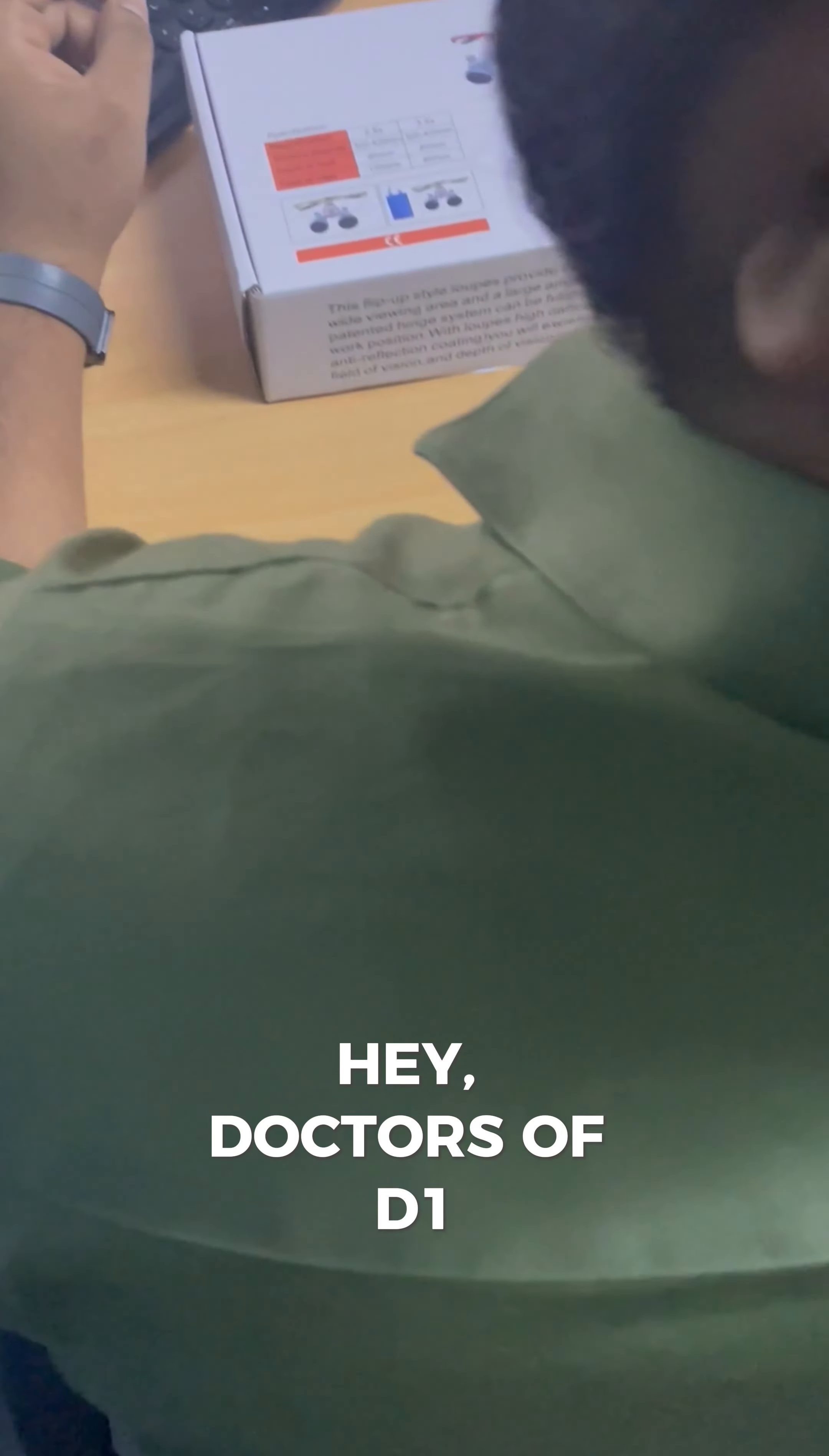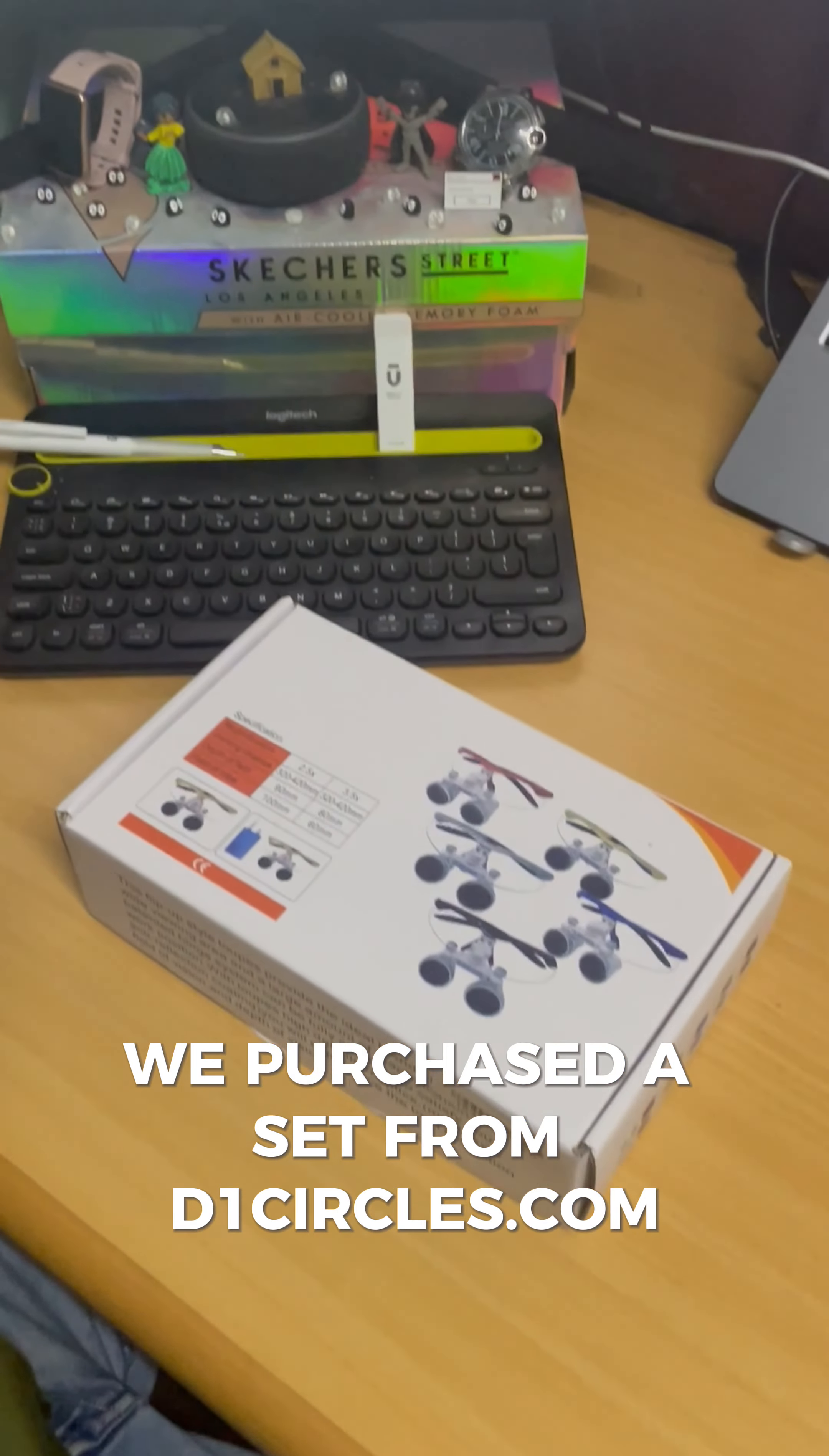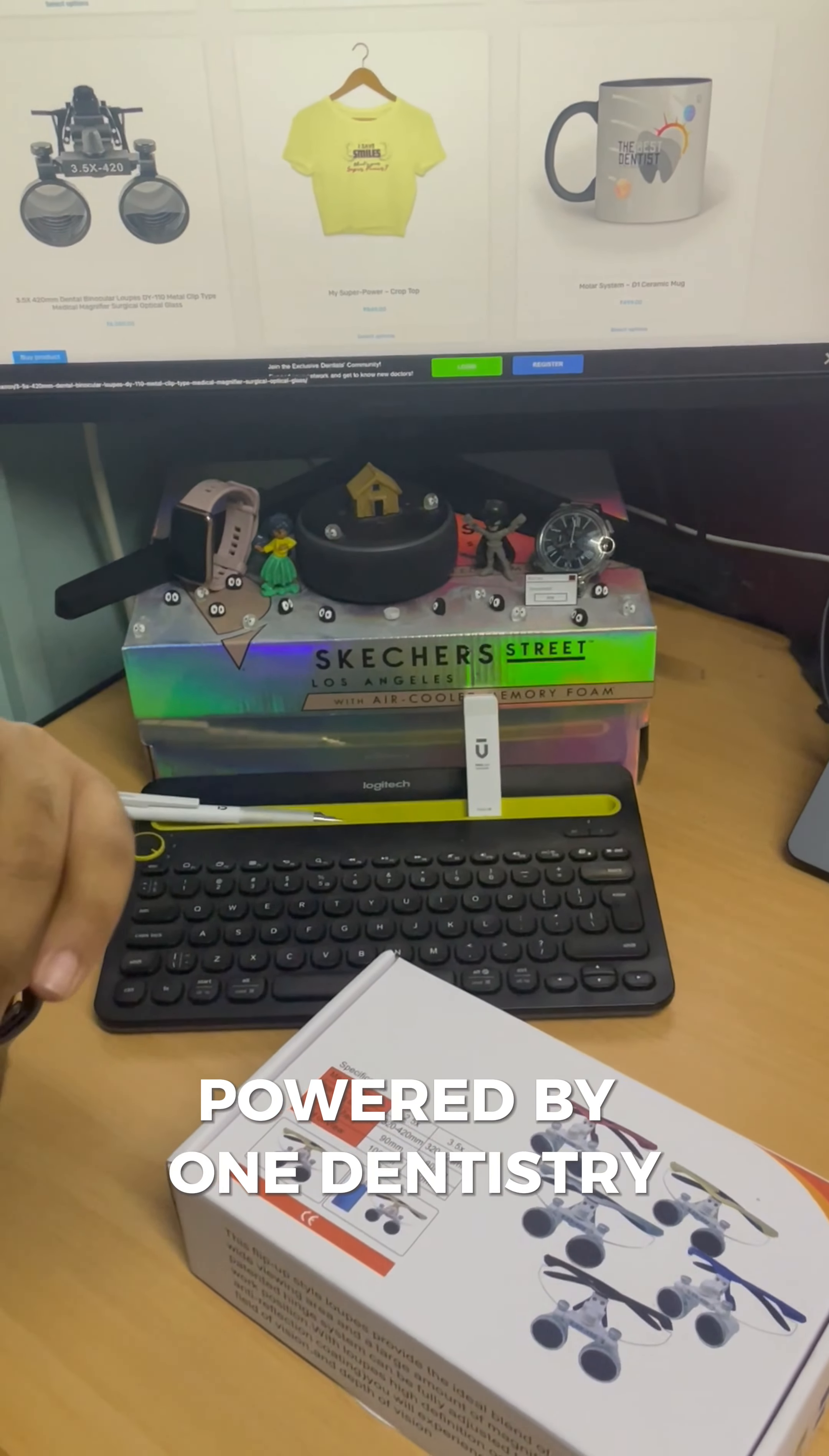Hey Doctors of D1, today we are checking out a basic dental loupe. We purchased a set from D1Circles.com powered by OneDentistry.